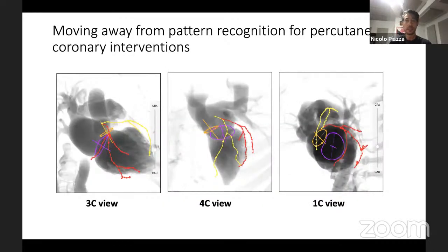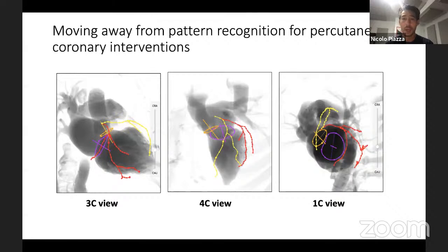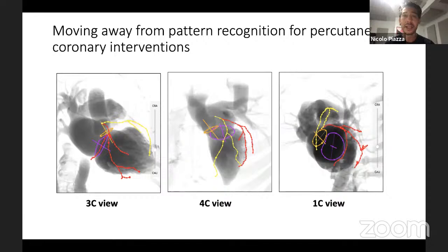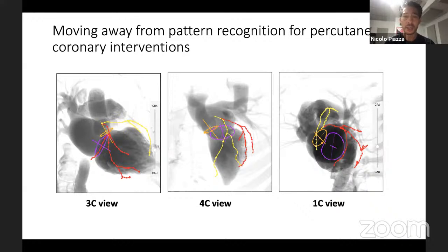Chamber views can be used to develop pattern recognition in structural heart disease and also in coronary interventions. In the future, we'll be moving away from pattern recognition for coronary interventions and becoming more patient-specific. Here you have a three-chamber view, four-chamber view, and one-chamber view of the coronary arteries. The red circumflex artery wraps around the mitral valve in the three-chamber view. The yellow LAD — all this time when you're injecting a coronary in LAO cranial, you were injecting in a four-chamber view.